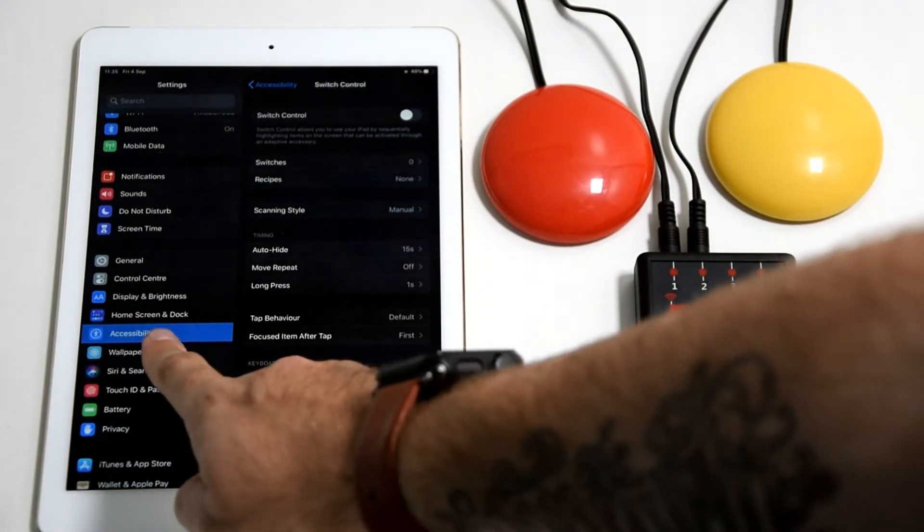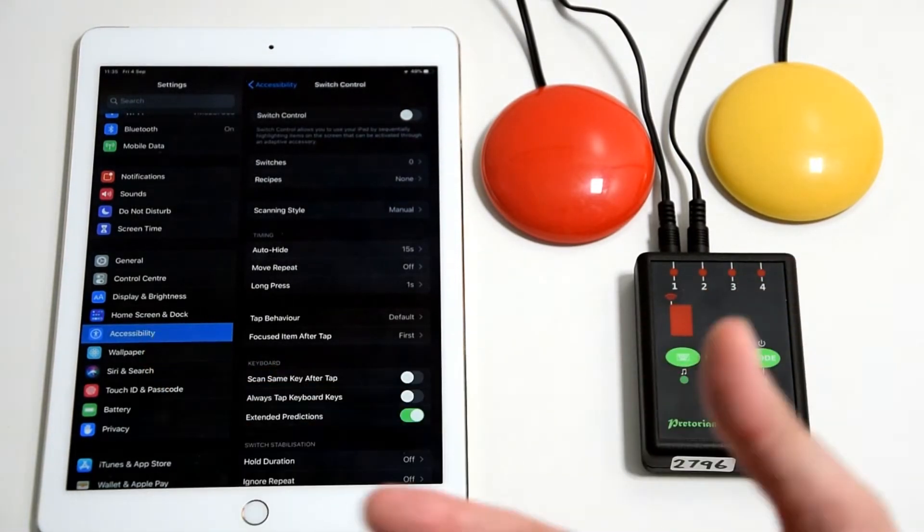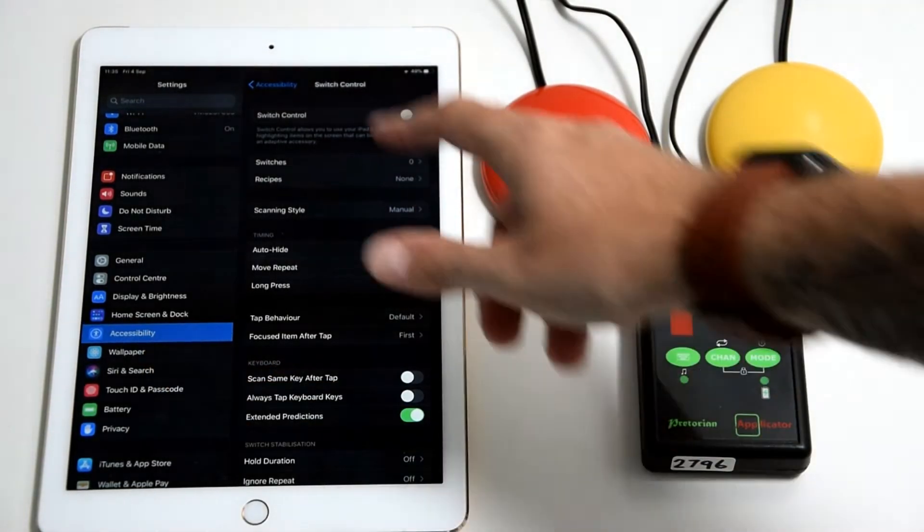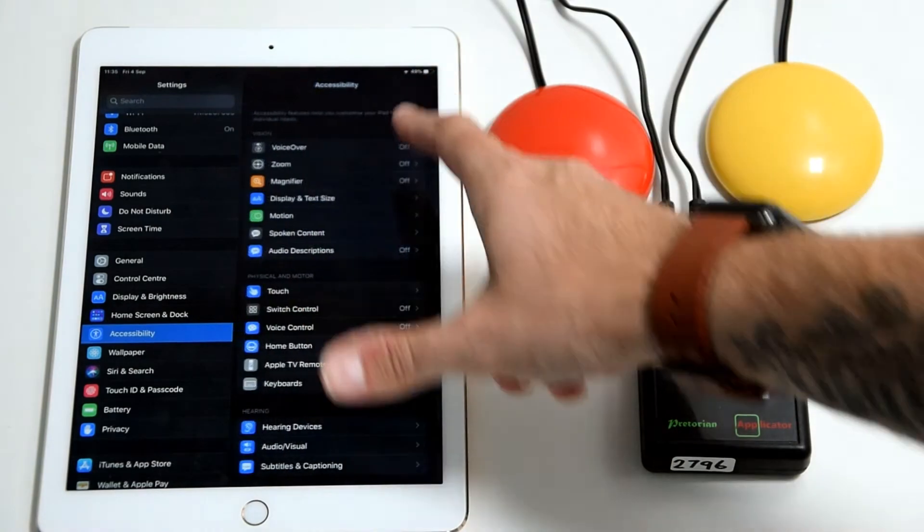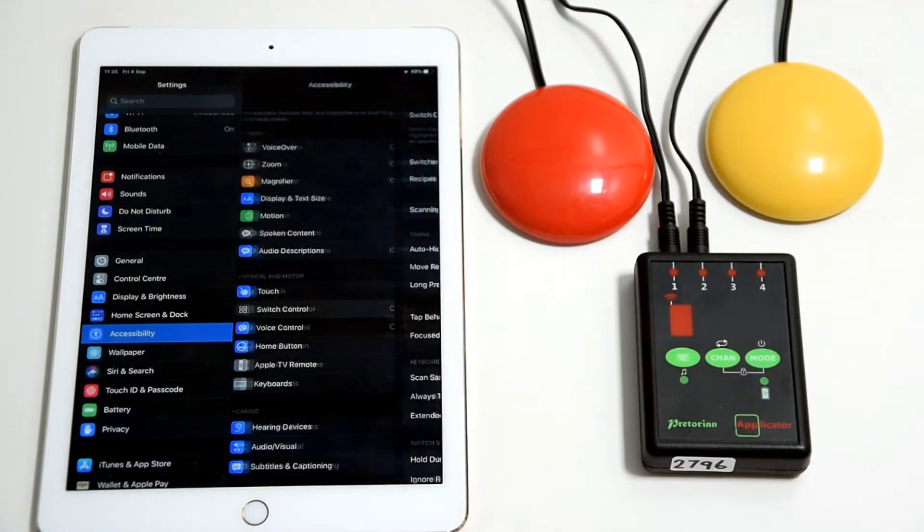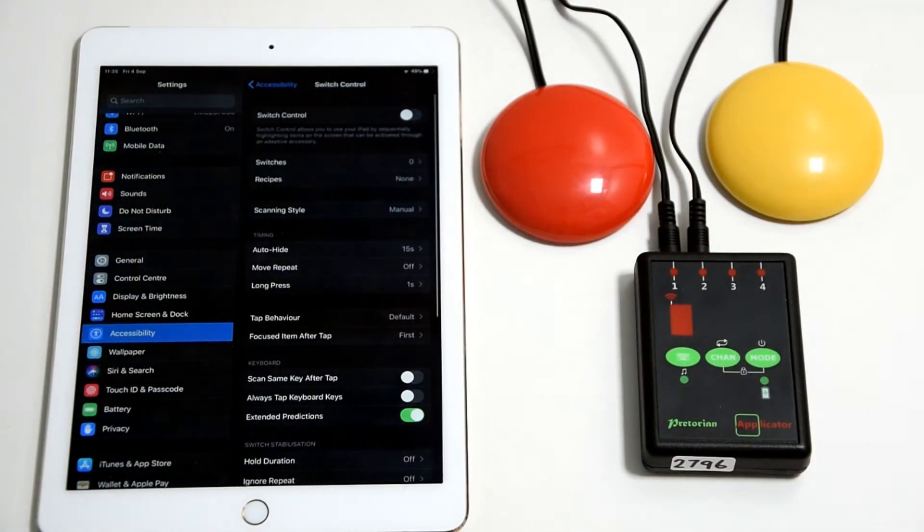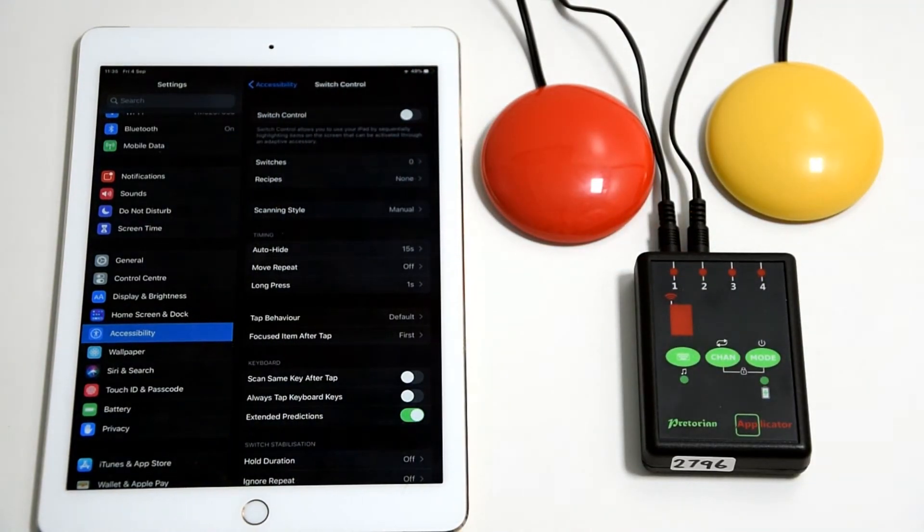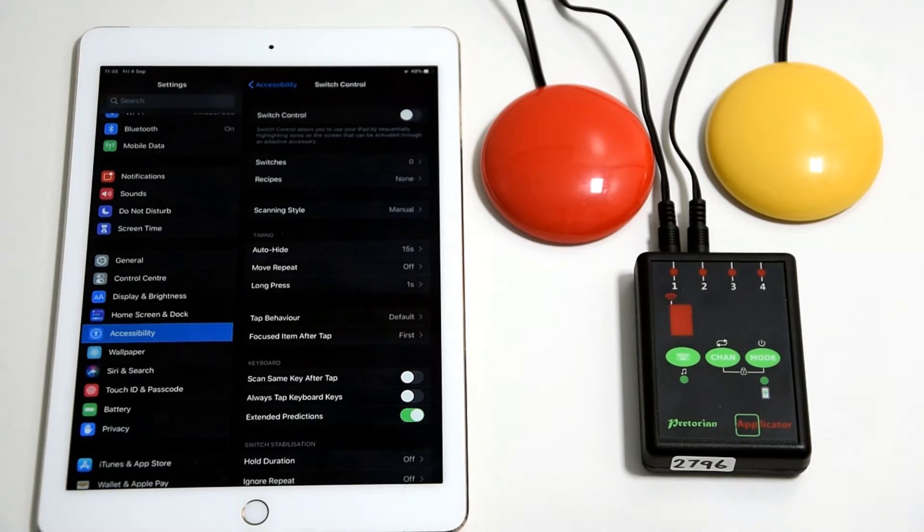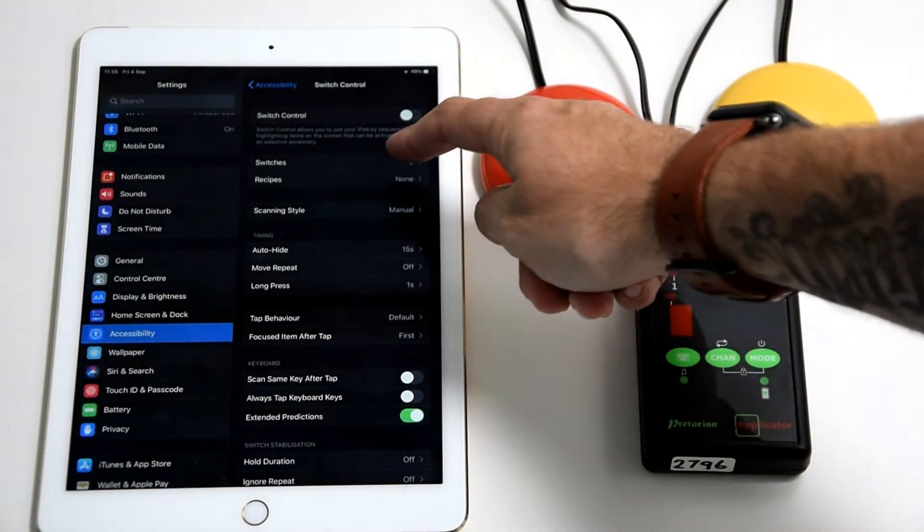Within the accessibility menu, you'll need to select switch control first. In the switch control menu at this stage, don't put switch control on, leave it off for now because we need to configure the switches first.